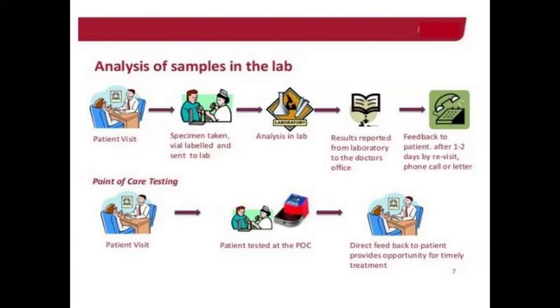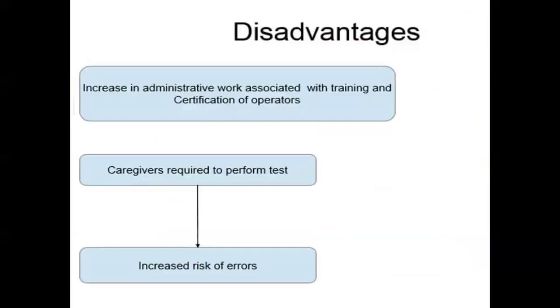This is the traditional way of doing the medication, which is given in the first half of the slide. You give the sample, then the report that is generated goes to the doctor, and the doctor will analyze it. So this is a one to two or maybe three day issue. But with point of care devices, you can analyze directly. If you have a question, you can go back to your doctor, discuss with him, and get a treatment or medication instantly. That is the advantage of point of care testing devices.